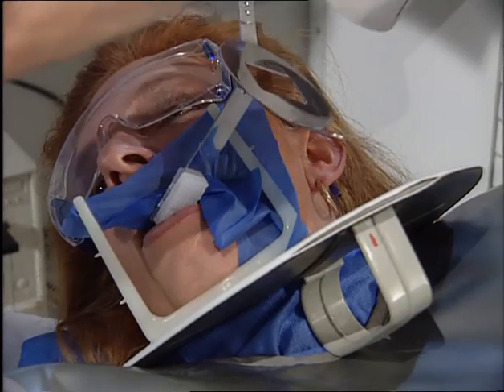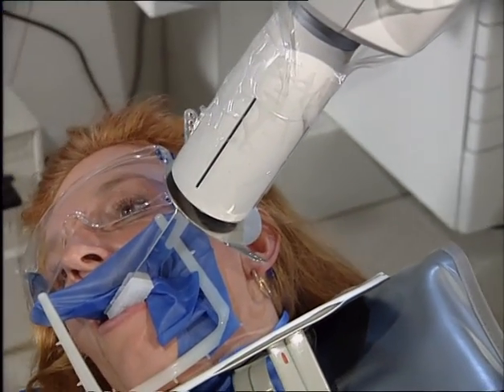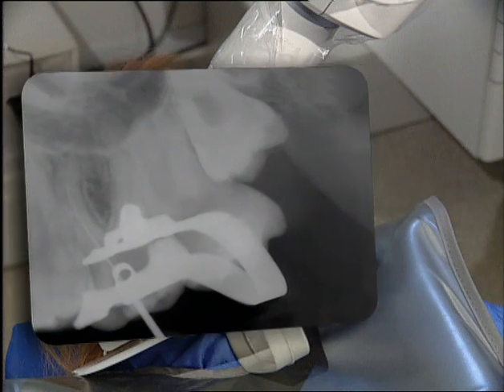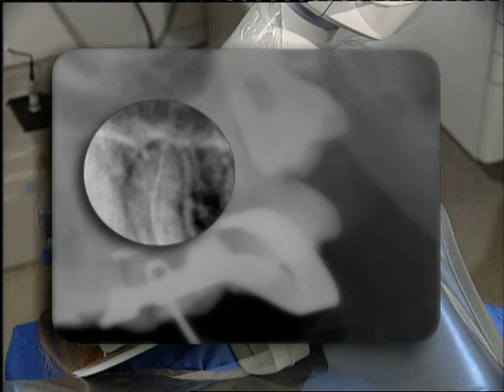The cemento-dentinal junction is not clinically meaningful and may vary histologically up to several millimeters. The radiographic terminus is used as a reference.